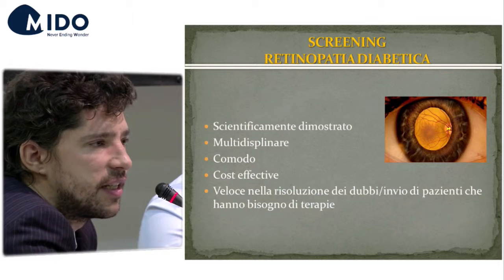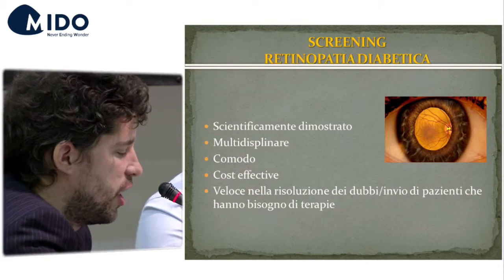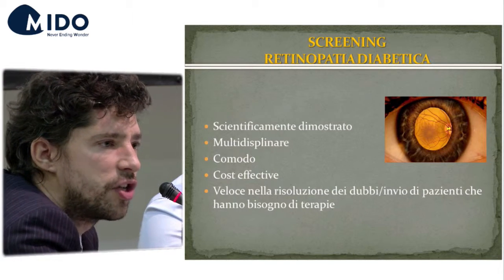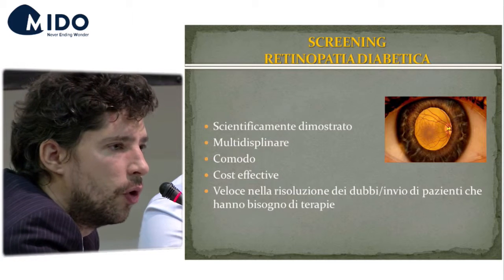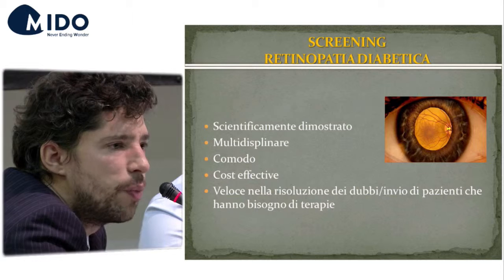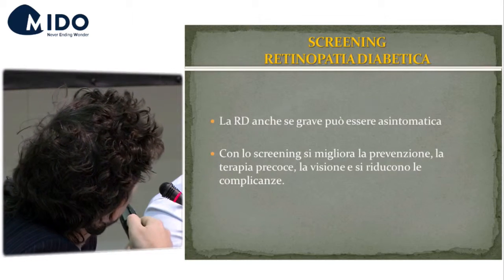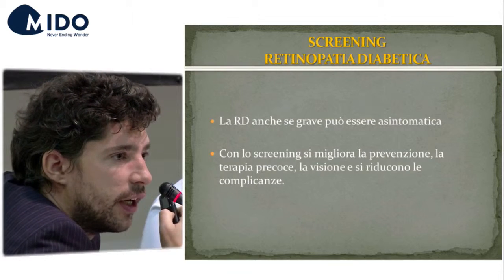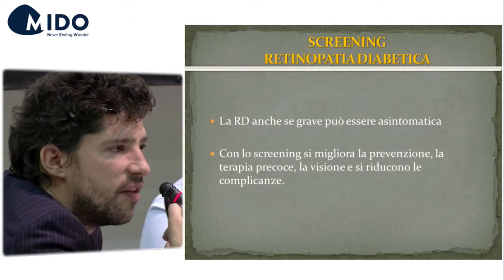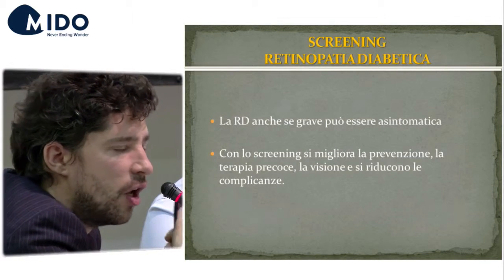If you have a program and a technician performs a test, then the physician visits the patient. If it's a physician performing this, it means that you prescribe a therapeutic plan, and also very severe forms, proliferative diabetic retinopathy that needs to be photocoagulated.